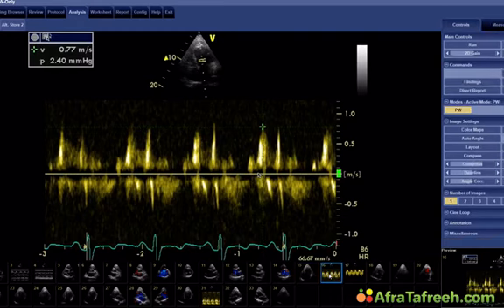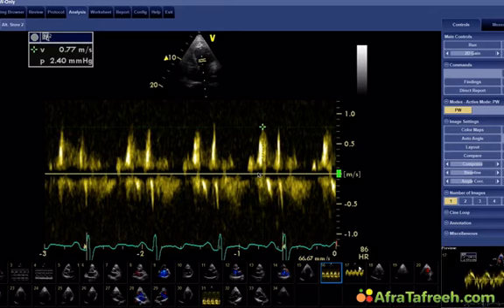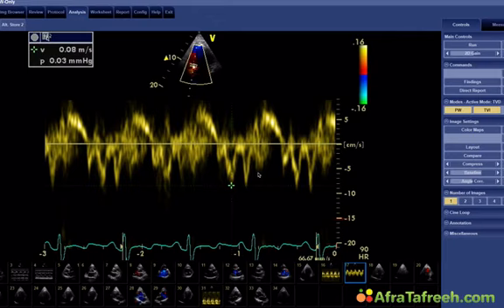Here is diastolic function. Now we can appreciate that he has maybe something in between restrictive filling and somewhere in between pseudonormal and relaxation pattern. Here is the Doppler finding at the mitral annulus. This is a question that was also asked by one of our users just right now. What you see is that the patient does have fairly high E prime velocity.